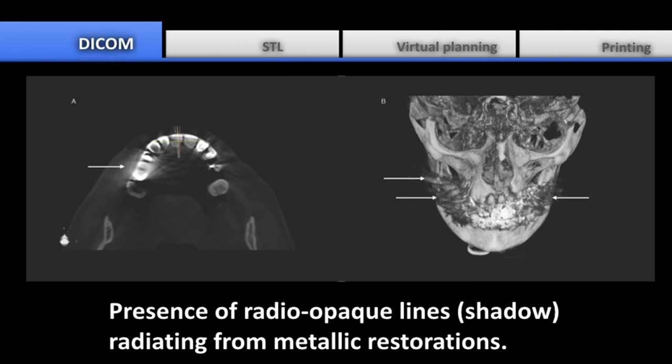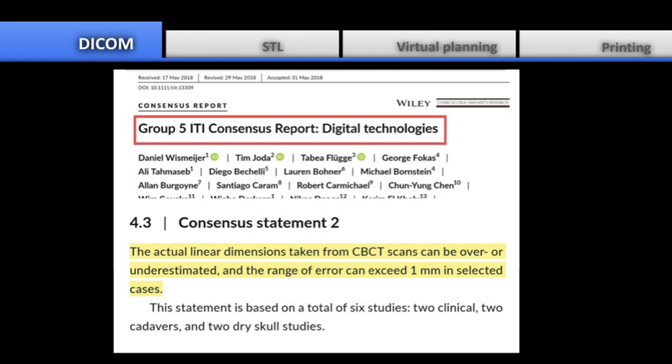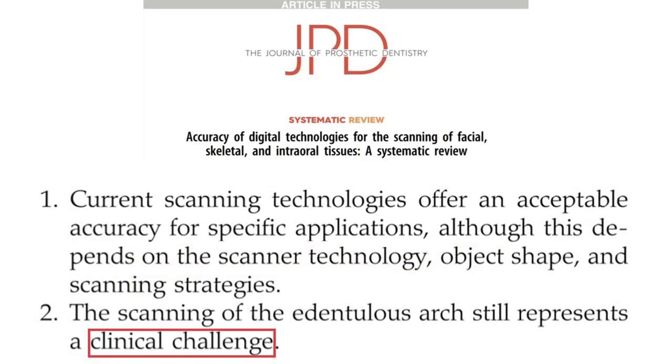Also, the presence of radiopaque lines radiating from metallic restorations can obscure the dental structure, which complicates the surface registration process. Furthermore, the same article showed that the margin of error in CBCT is under- or over-estimation by 1 mm. Another recent systematic review showed that accuracy is limited to specific applications in terms of intraoral or extraoral scanners, and the scanning of a completely edentulous arch is still a clinical challenge.